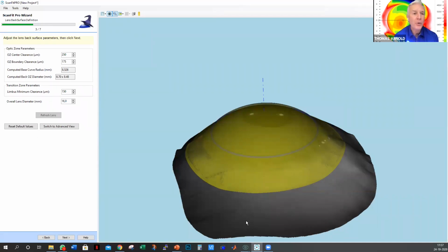When we do empirical fitting, meaning that we're just going to use the scan to order even the Scleral lens, the shortcut way, we found it very, very useful over time, is we can just pop a corneal RGP lens on that eye, known base curve, known power, over refract that. And that as well will enter into the calculator that we find there, and that works really well.